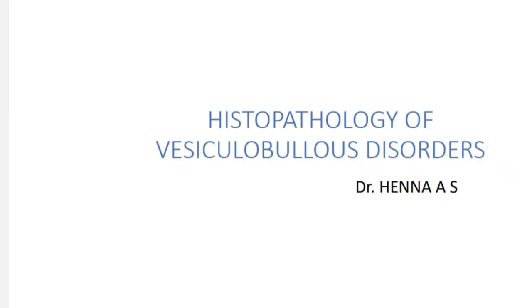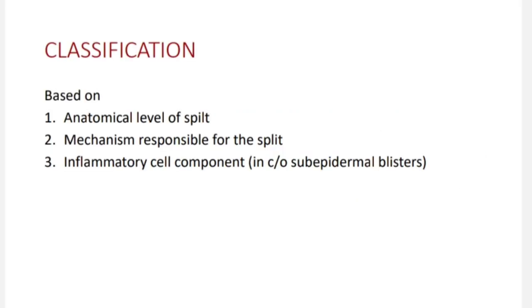Good morning. The topic for today's presentation is Histopathology of Vesiculo-bullous disorders. So, histopathologically, vesiculo-bullous disorders can be classified based on anatomical level of split, mechanism responsible for the split, and inflammatory cell component. And this is mainly for subepidermal blisters.